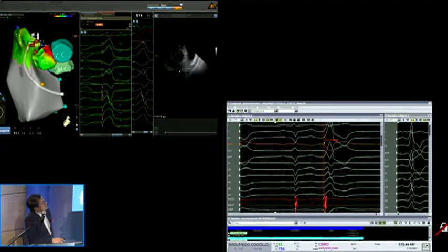But we agree that it has to be an area that you're seeing in the echo between the right cusp and the RVOT. So which would be the approach? Do we go back to the left and start applying on the left side, or should we do some contralateral applications here? And probably we're going to end up doing them at the end of the day.